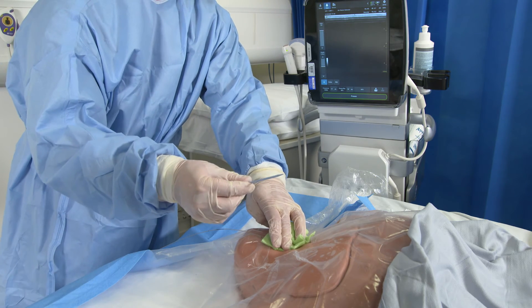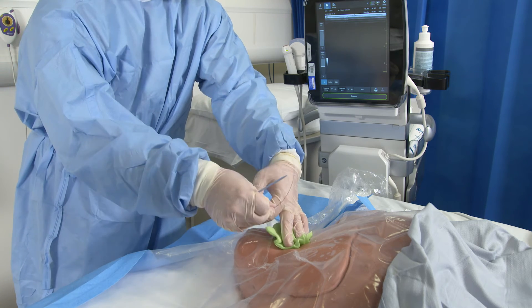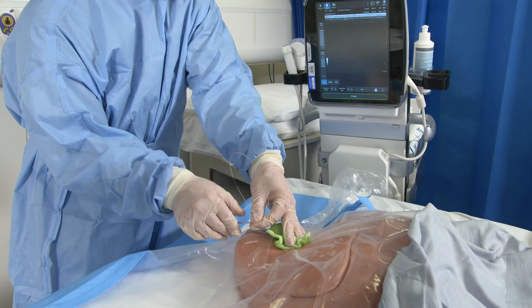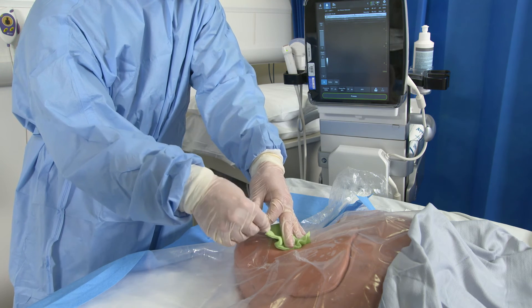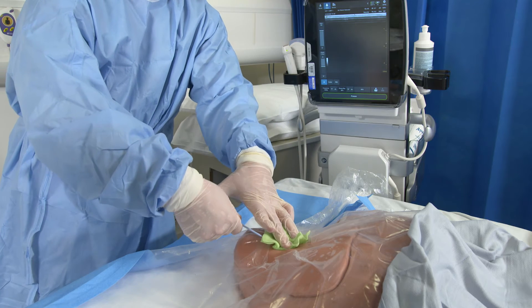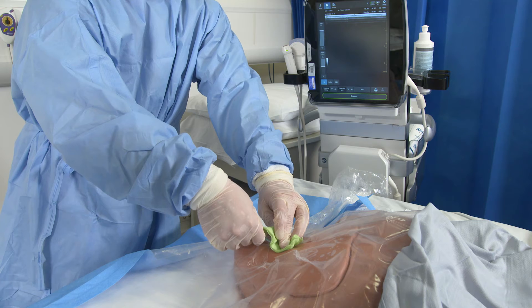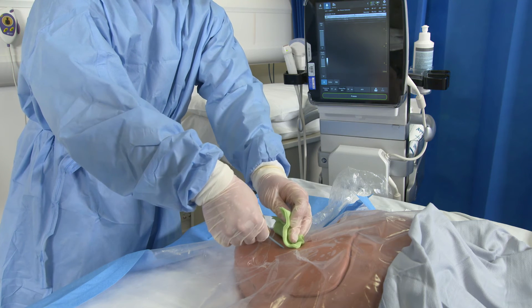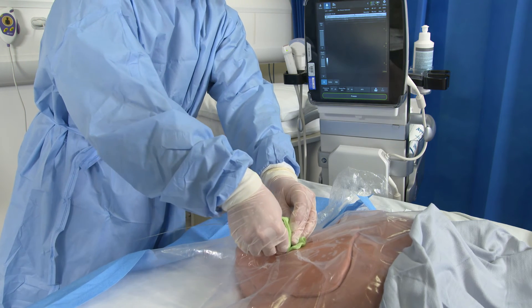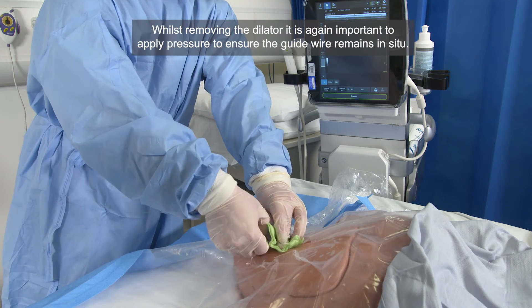Following this, take the dilator and thread it over the guide wire. Whenever you're inserting anything over a guide wire, always ensure that you have plenty of wire visible above what you're putting into the patient. Warn the patient that they're going to feel some pressure and then insert the dilator down the path of the guide wire, and remove.